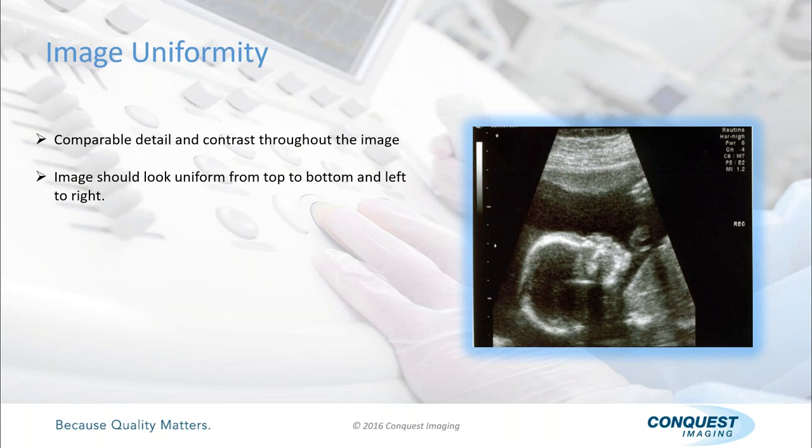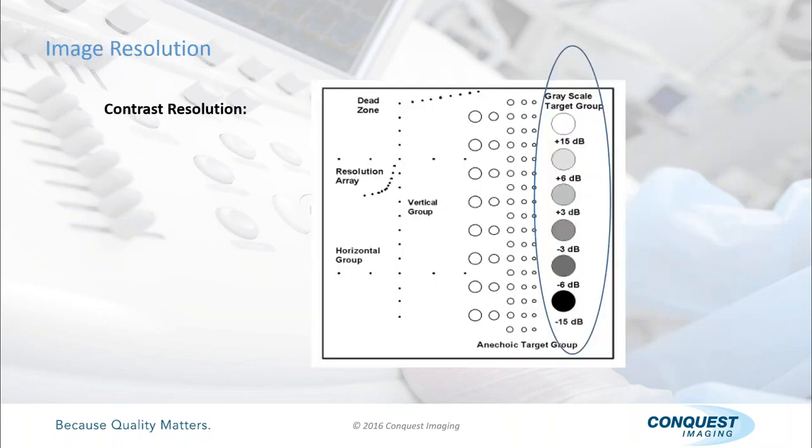Does that make sense? Because they're different densities, right? So when we look at these 6 objects, we want to not only see the objects, yes, I can see them, but we want to see that this is different than that.